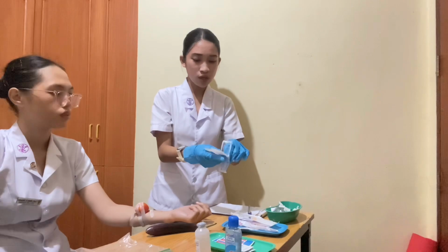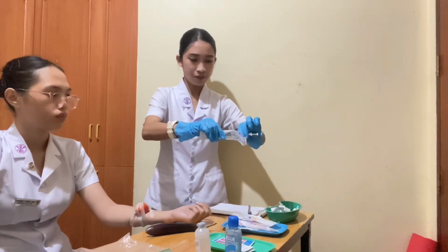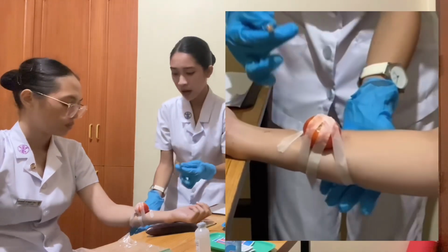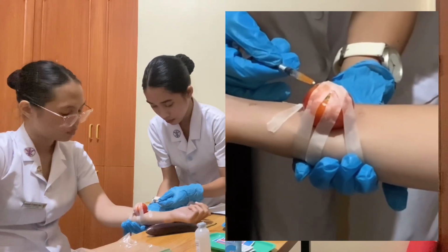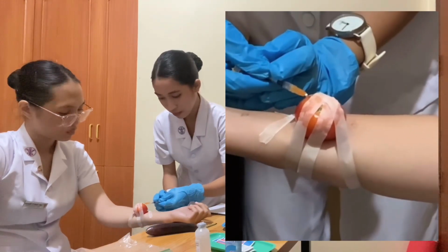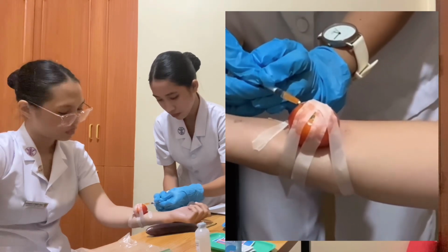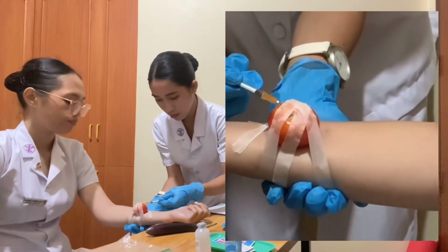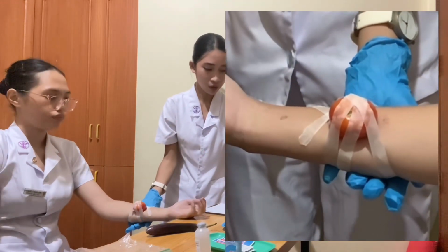Ma'am, I'm just going to inject na, ha? Expose. Ma'am, nag-inject na po, ha? Relax lang, ma'am. So, 10 to 15 degrees angle. And ma'am, just relax. Inhale, exhale lang. Okay. Okay, thank you, ma'am. So, tapos na po, ma'am, ha? Dispose the needle into the sharps container.